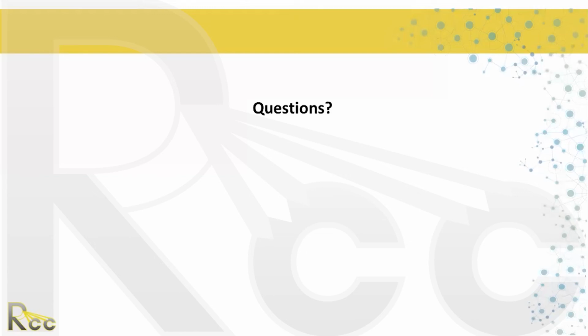Great, thank you. And then someone asked if you could briefly explain IGRT again. Okay, IGRT is image guided radiation therapy. So that means that every day, basically, we're going to take a film and make sure that we're correct. So we're not just visually looking at the light on the patient and confirming and treating. We're actually going to take an image and apply the shifts. Older systems will make you go in the room and manually shift the table. The newer systems, you just apply the shift and it shifts in the room.